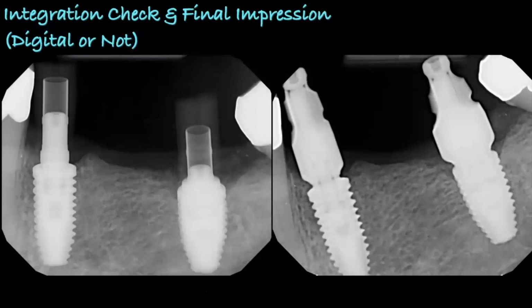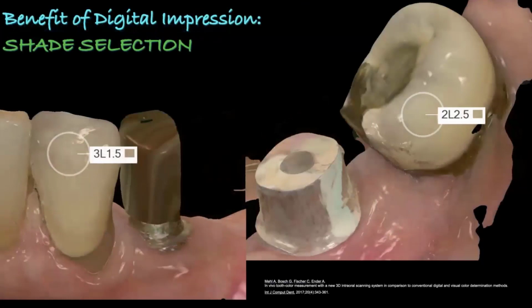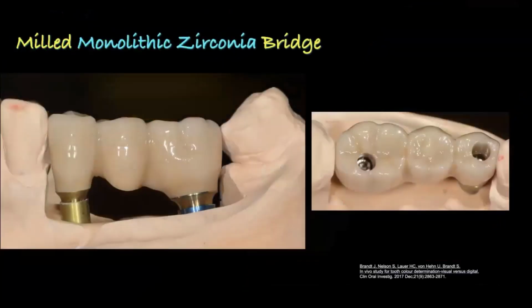And so then when we go to take our final impressions, we can take digital or non-digital impressions. And in this whole workflow, then we can utilize iOS scanning. Sometimes it'll help us take a shade, which is pretty cool. Like I said, more and more things are available in digital technology and utilizing cone beam CT scan technology, and that is pretty amazing. And so in this case, like I said, we're looking at exactly where our implants are. This is a monolithic zirconia bridge, one of the first ones we did back in the day.